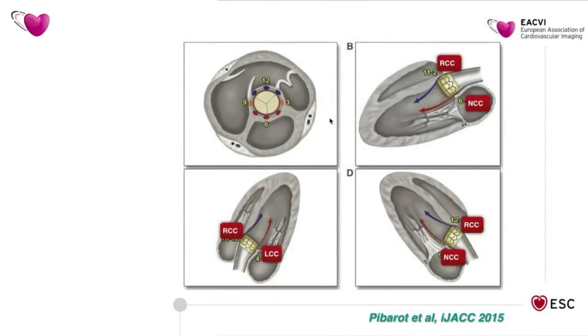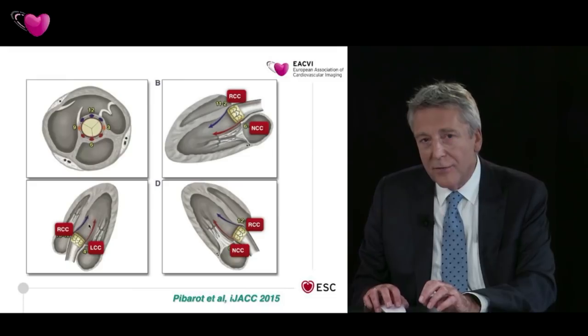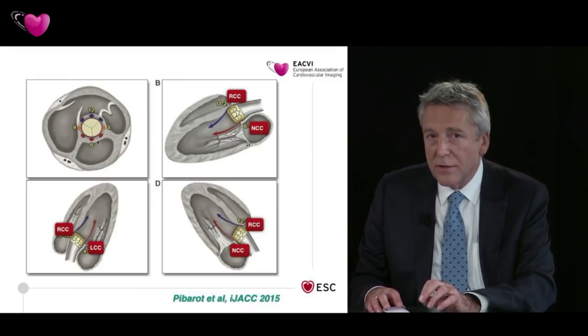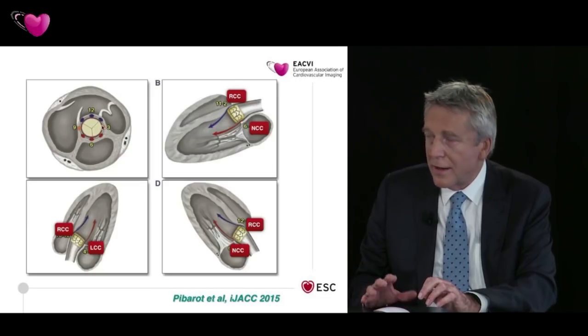And this slide really from that publication shows you the principle, shows you the different echo views that you can do to use this and summate all these different jets that you can get, because they go every which way in this setting.